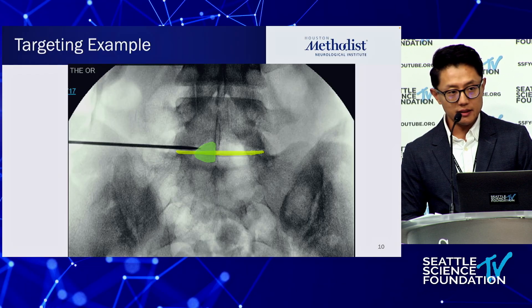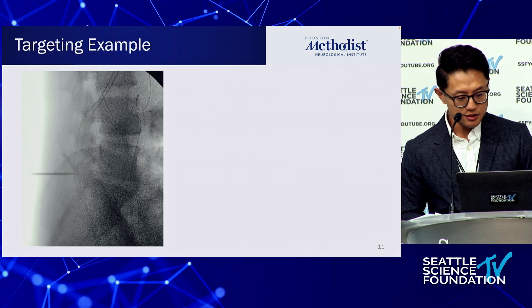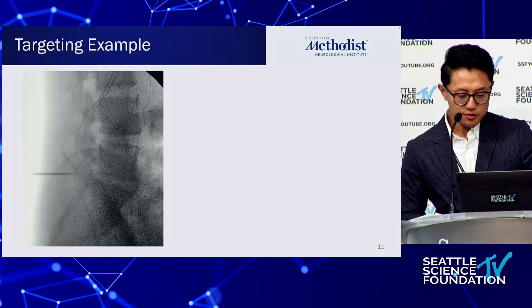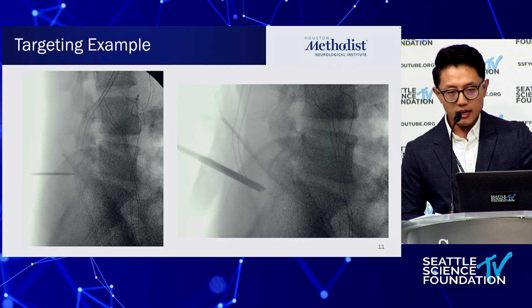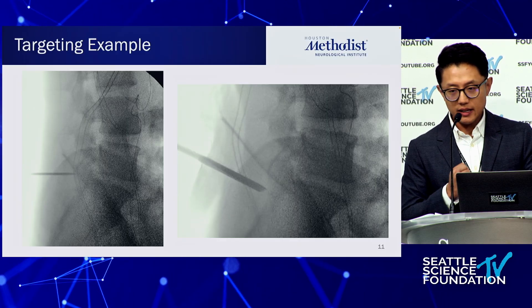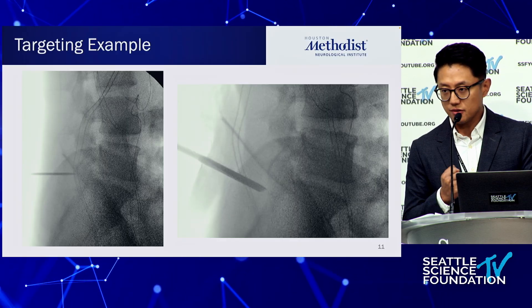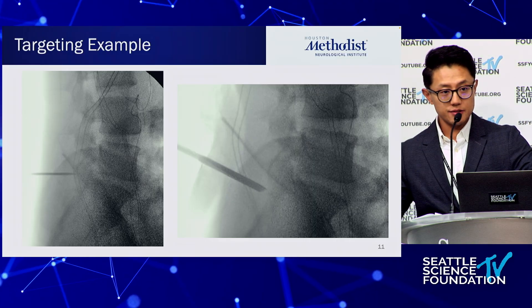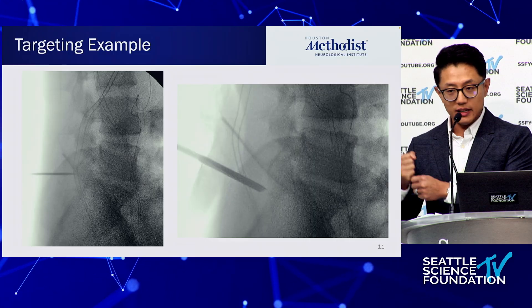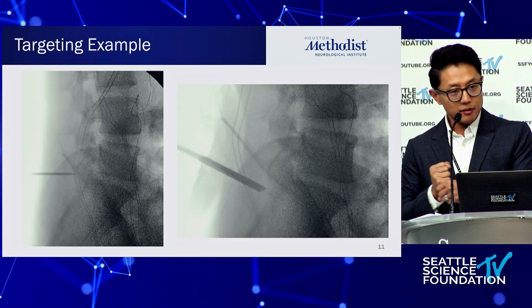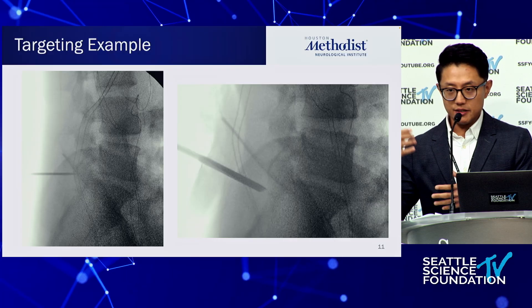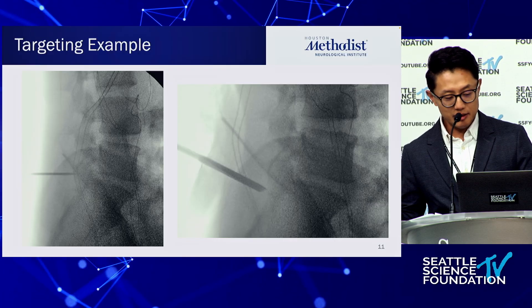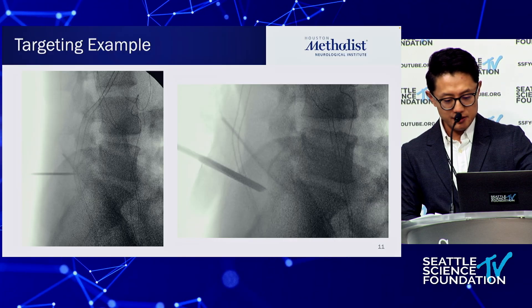My marking trocar and skin incision are placed exactly at the tip of the trocar, right at the laminar-IAP junction. Once you go down with your trocar and sequential dilators, it's important to take some time and scrape the muscle off the bone — just like a tubular case. You put down your tubes and scrape so there's more muscle out of the way.